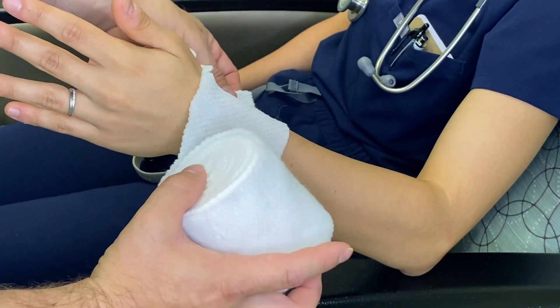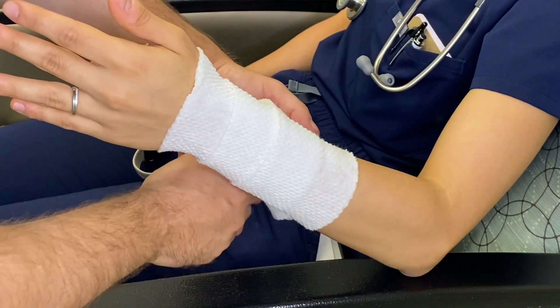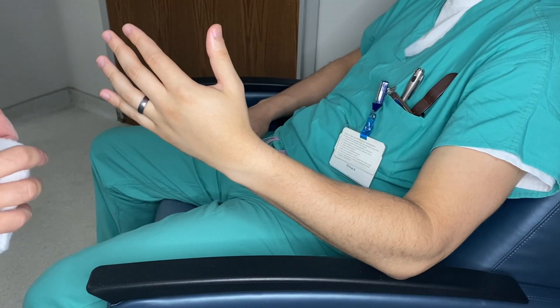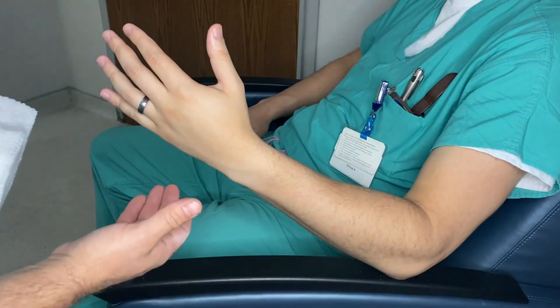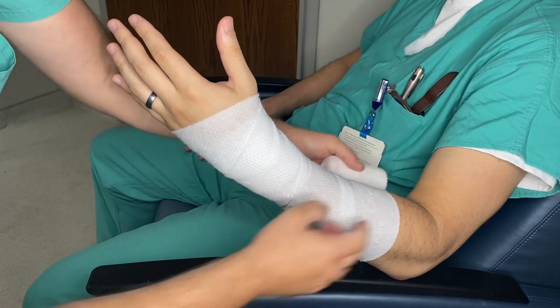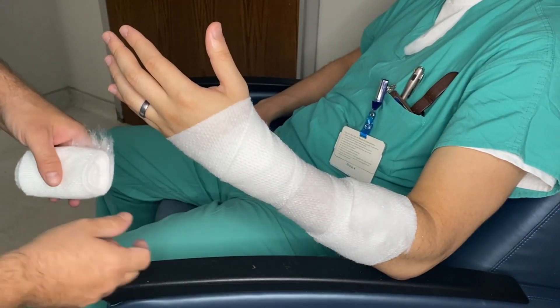This is the 50-50 method when rolling web roll or cotton during splints and casts. What you have is a 50-50 overlay exposing a dark side and a light side. This makes the web roll and cotton even throughout the whole splint and cast and will not expose skin to plaster or fiberglass. Now that I've shown you the correct way, I'm going to show you the incorrect way. A lot of people when rolling tend to get in a hurry and do not get correct layers nice and even throughout the whole arm — you'll see four or five layers in one spot and then only one layer or exposed skin in another. This is the incorrect way because you can easily burn a patient.